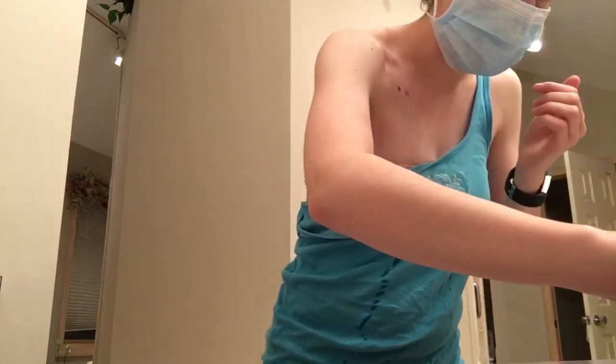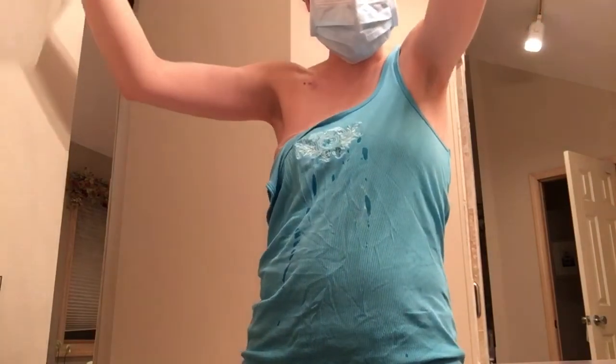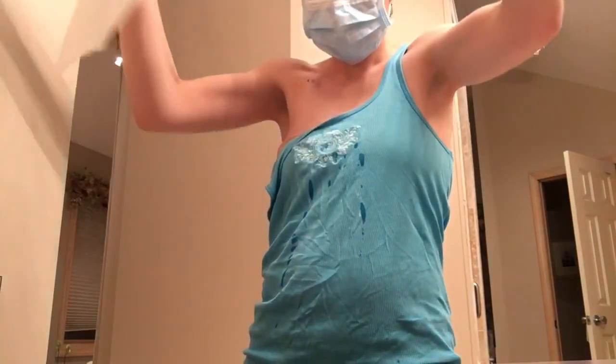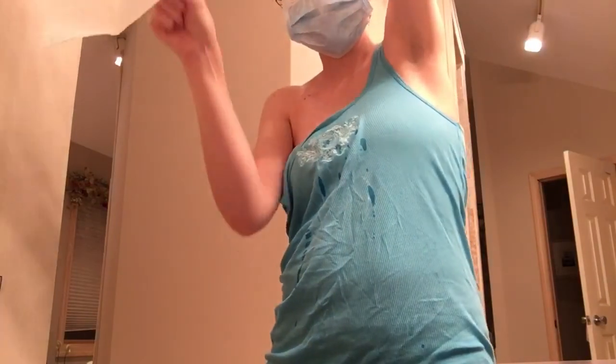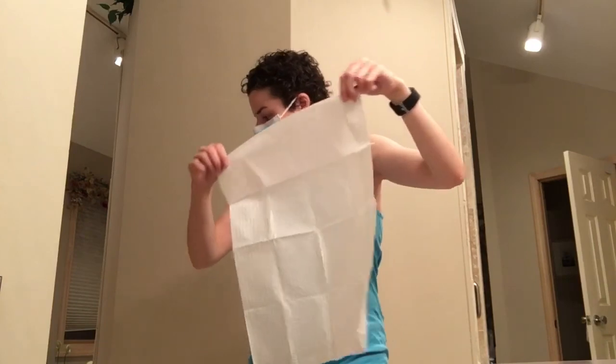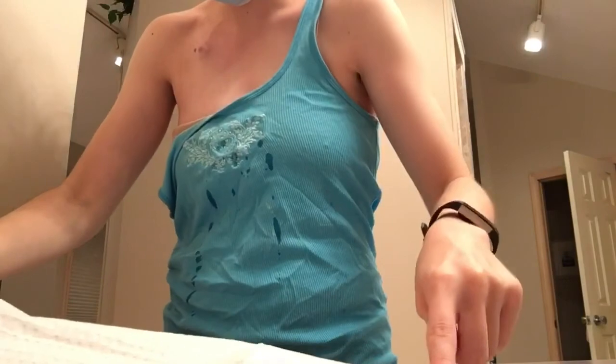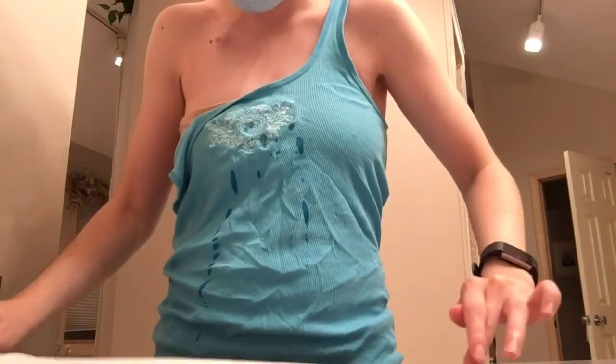And now I'm going to get the sterile field out, which I'm also touching only the very edges of. So I'm being very, very careful, only to touch the edges. And I'm placing it, it's not unfolding all the way. And I'm placing it right here. I am not sterile yet.